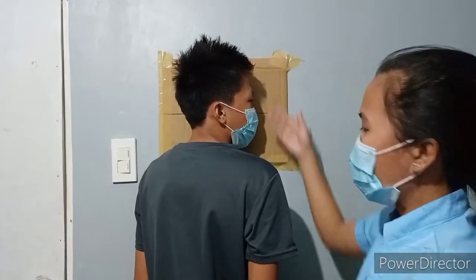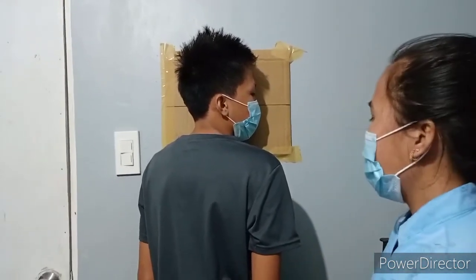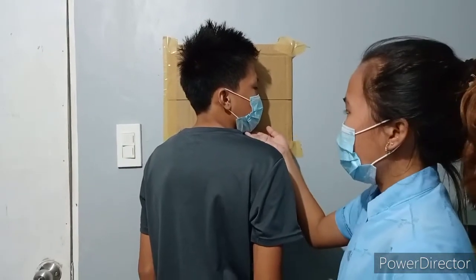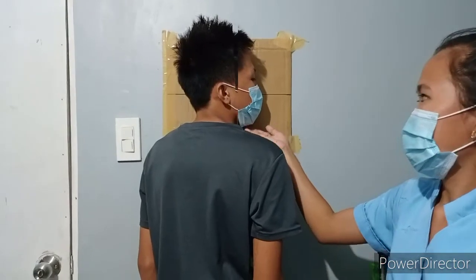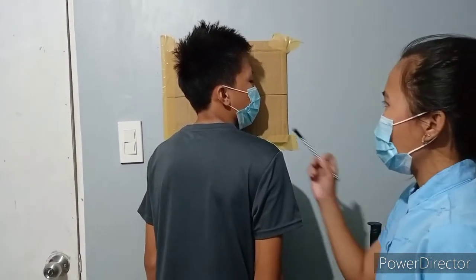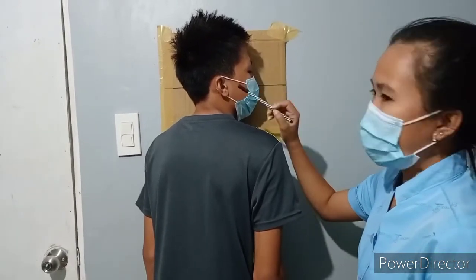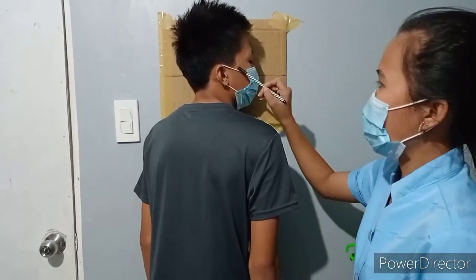The MSP, or the mid-sagittal plane, should be parallel to the IR, and then adjust the chin so that the IOML should be perpendicular to the edge of the IR. Center the central ray to a point between the outer canthus and the EAM of the patient. The reference point is here.